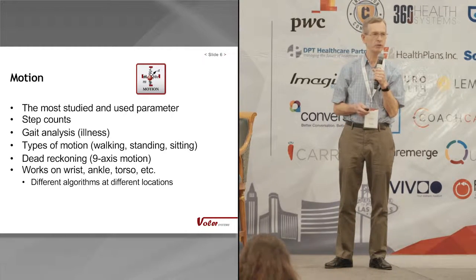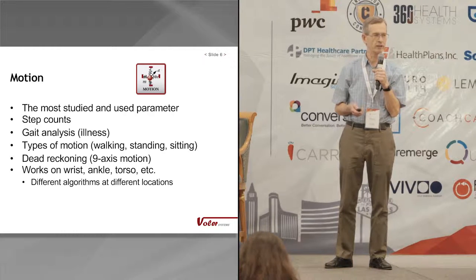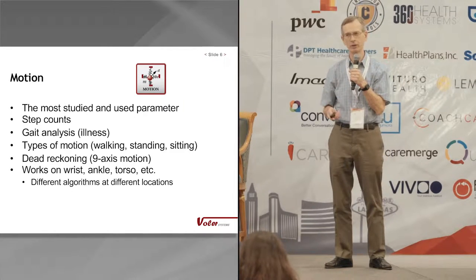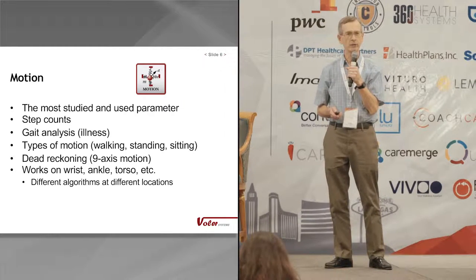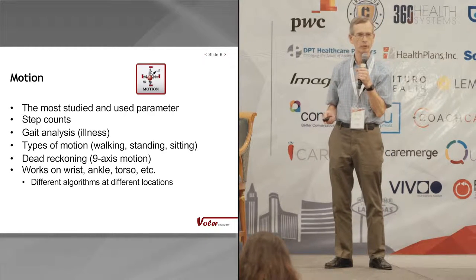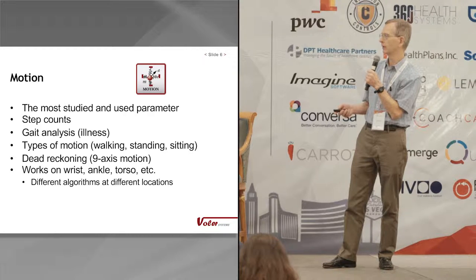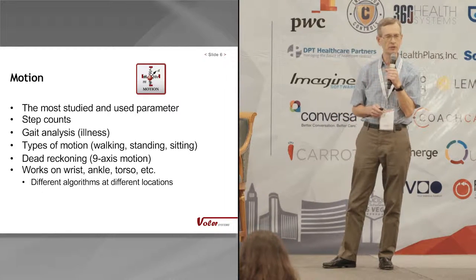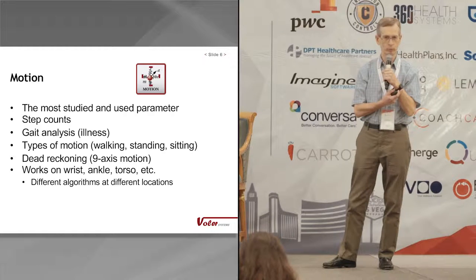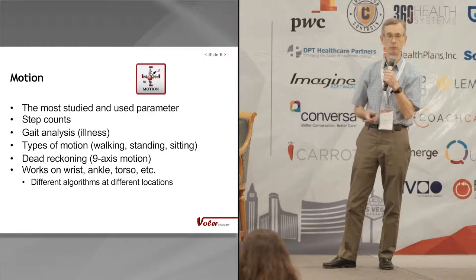For example, if you've been sitting still in a cold environment, your skin is going to be much colder than your core. But if you've been moving around and you're active, the skin may be at the same temperature. However, if you've been really active and you've been sweating, again, your skin temperature may be lower. So by knowing what activity you've done and the ambient temperature, you can figure out certain times when you can actually measure the core temperature on the skin. So algorithms and sensor fusion are what you would use. The other thing to be careful of is the sensor needs to make good contact with the skin. If you have something on your wrist, for example, I wear my watch rather loose. And if it's loose, it may not make good contact. And if I have a temperature sensor in there, it may not even measure the skin temperature accurately.